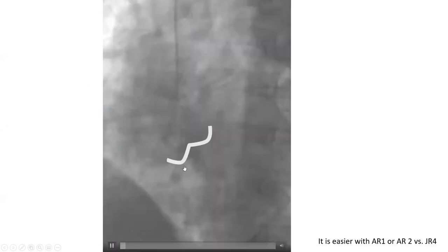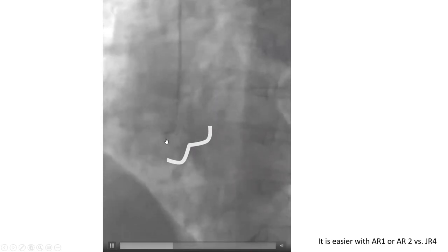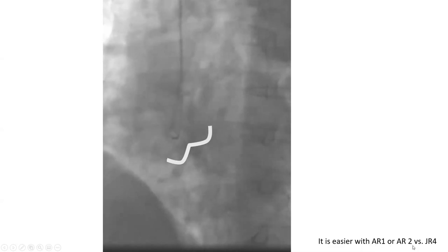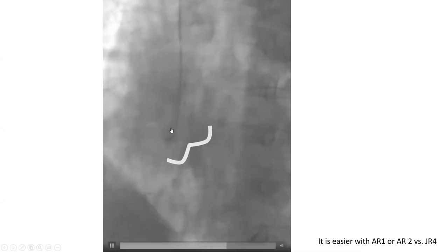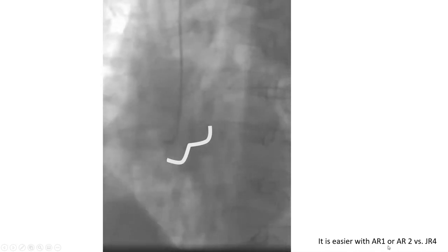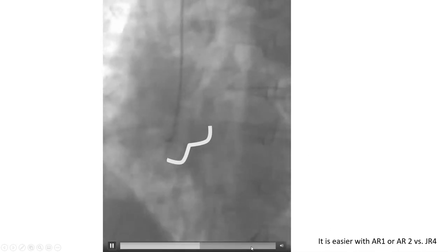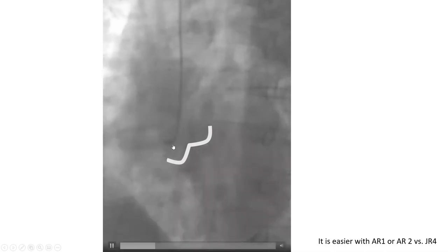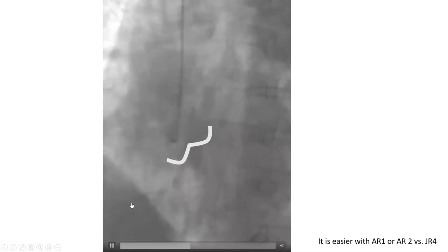The same fellow in another case: he came below, he counter-clocked, then pulled and clocked again, and that got him into the coronary. It's easier to do this with an AR1 or AR2 catheter versus JR4. This was a JR4 — it is a little more difficult to use in radial maneuvering compared to the Amplatz right catheters. Once you get it in, you'll notice it's usually barely in — you have to push it to stabilize it. Otherwise, the patient takes a deep breath and it flies out. If you're below, counter-clock a little, pull and clock, then push it in to stabilize it.